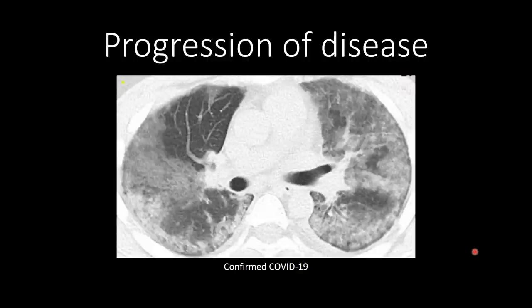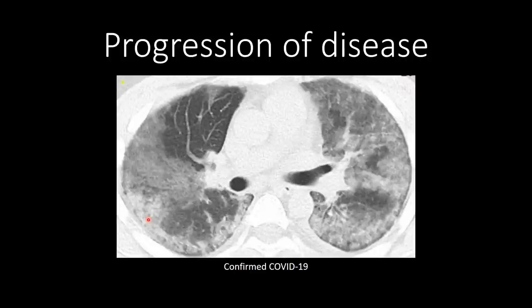In more progressed or severe cases of COVID-19, you may see diffuse ground glass opacification with areas of consolidation. In this case the process is still predominantly peripheral and ground glass predominant, with diffuse lung disease and areas of developing consolidation.